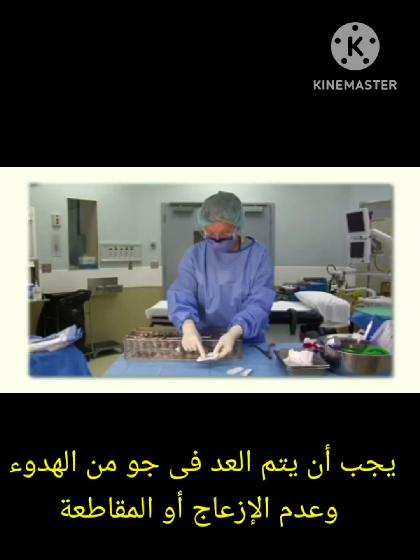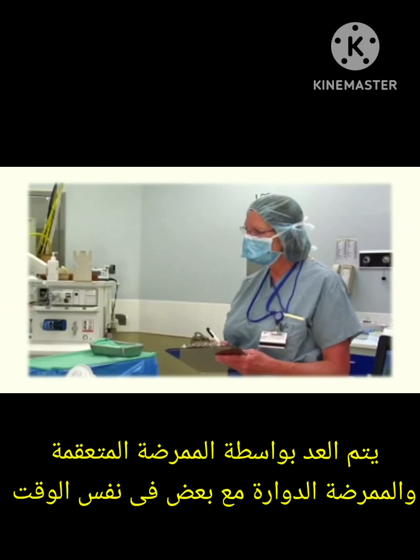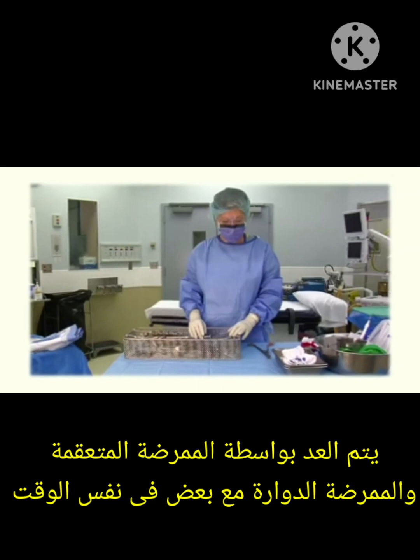There should be no extra noise, distractions, or interruptions during the count. The count in and out may be initiated by either the circulating or the scrub nurse, according to health care facility policy.